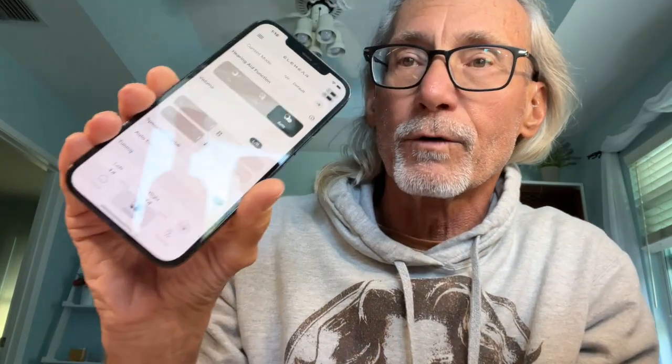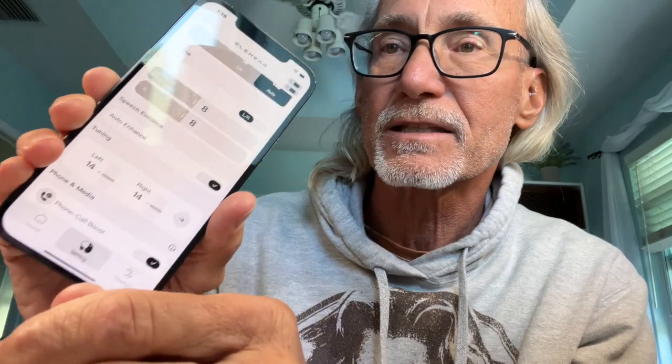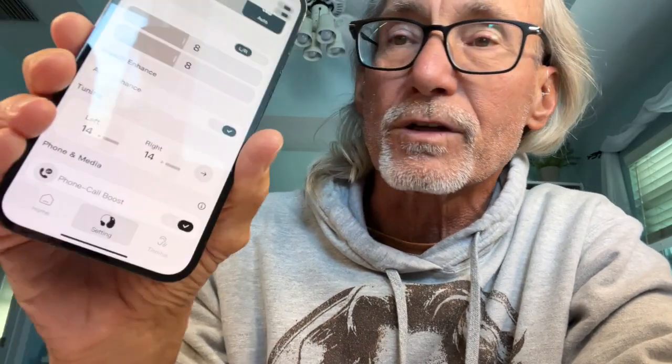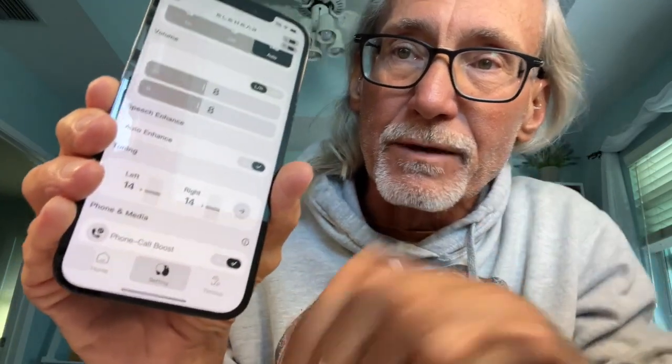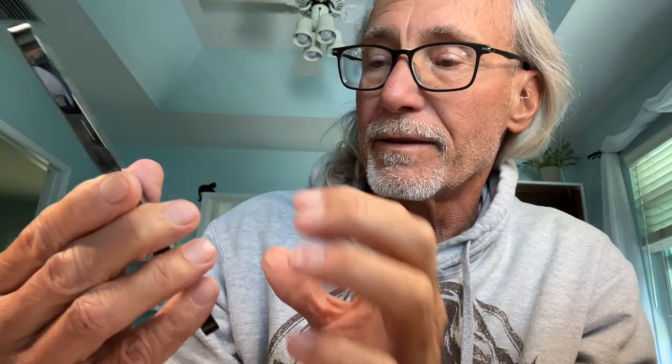Now, they have an auto enhance, which it's already set. It's got on and off, right, and auto. Let's slide up a little bit. It says speech enhance. So speech enhance, I guess we can do auto enhance, and that does that. Tuning. All right, so you can tune the left and the right. You see right here? All right, call boost. I've got that on there. And that's pretty much it.